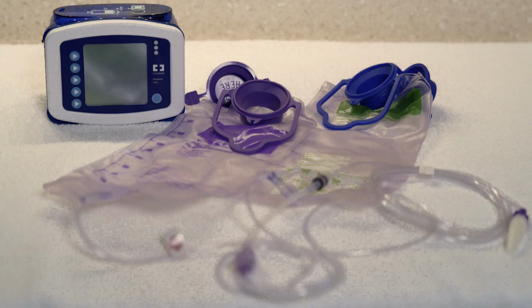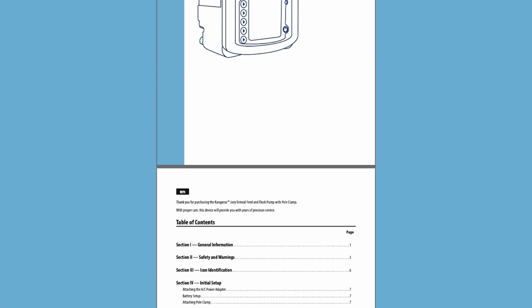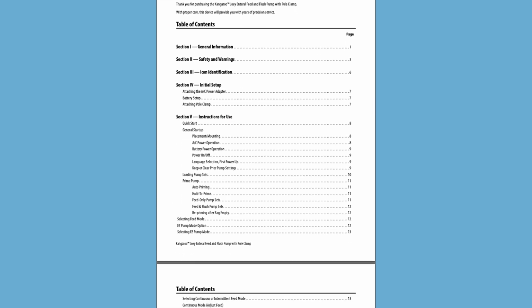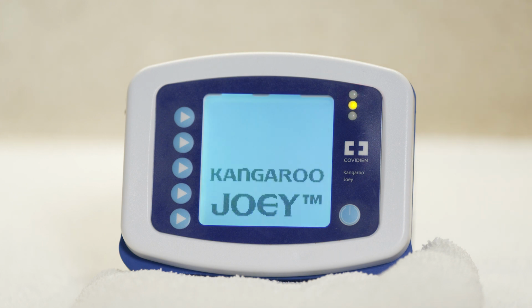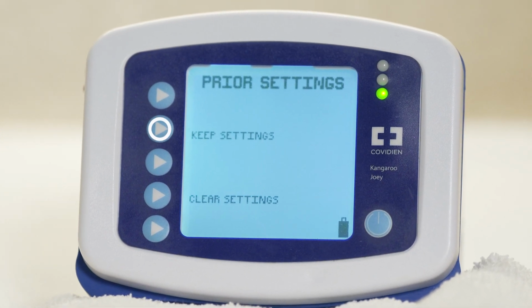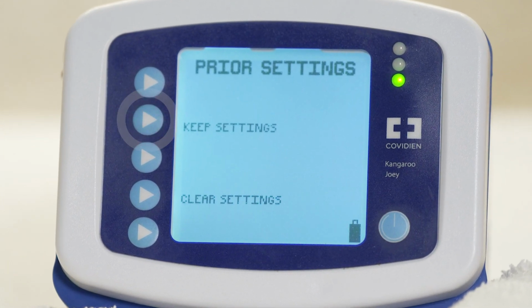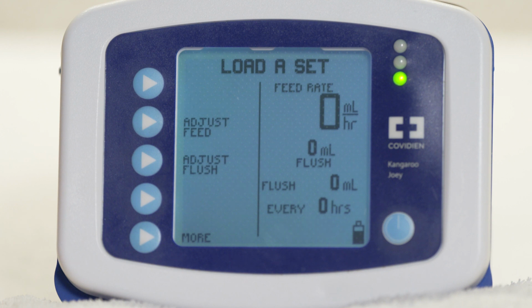A home supply company will provide you with supplies to give yourself feedings. You will get a feeding pump, often called a Joey pump, and an instruction manual. The manual can help you troubleshoot if you have problems. To turn on the pump, press the power button located on the bottom right of the pump. Press Keep Settings or Clear Settings. Press Keep Settings anytime the pump is turned off and turned back on to prevent having to reprogram the pump.